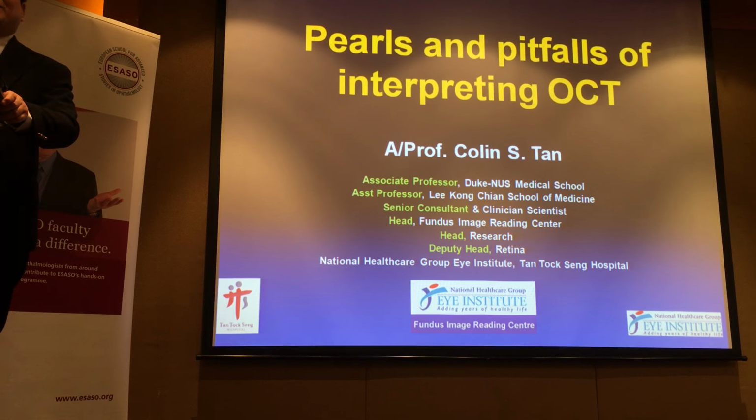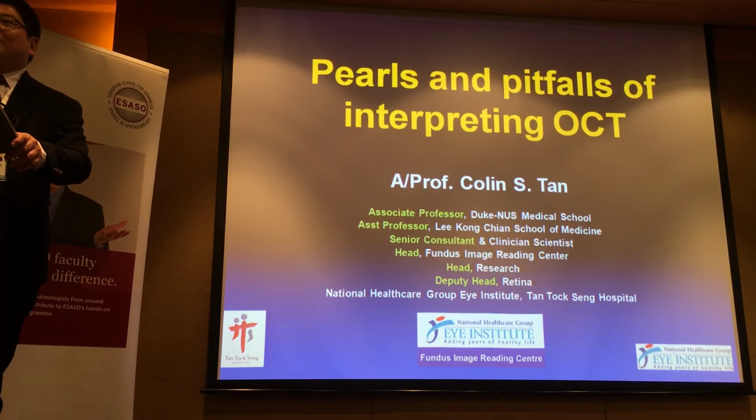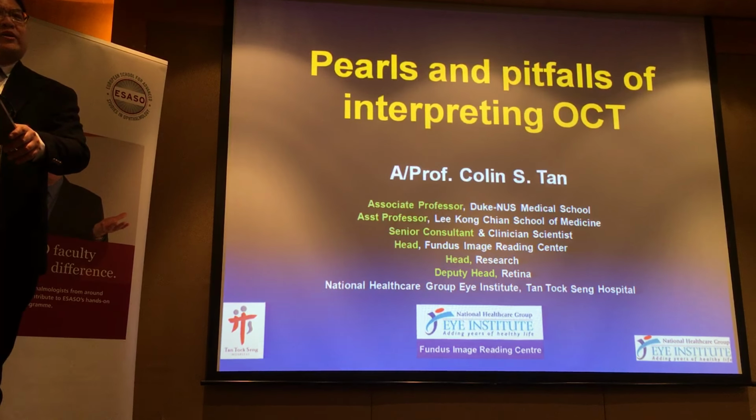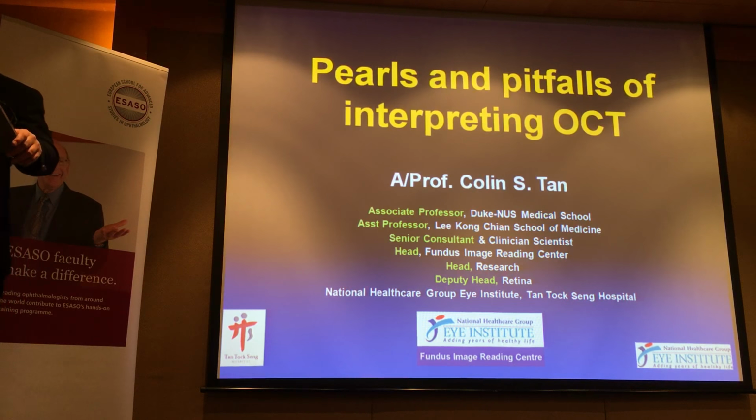I was just relating my experience, although I may be carbon dating myself, when I was a junior consultant running the general clinic with my medical officers and residents, when the resident came and said, there's this patient previously treated for diabetic macular edema, came for follow-up, vision is good, there's clinically no significant macular edema. Oh, but I'm going to send for an OCT anyway. And I just frowned and said, why are you sending for an OCT? It's clinically normal, right? So, why waste the investigation? Now, that was the day.